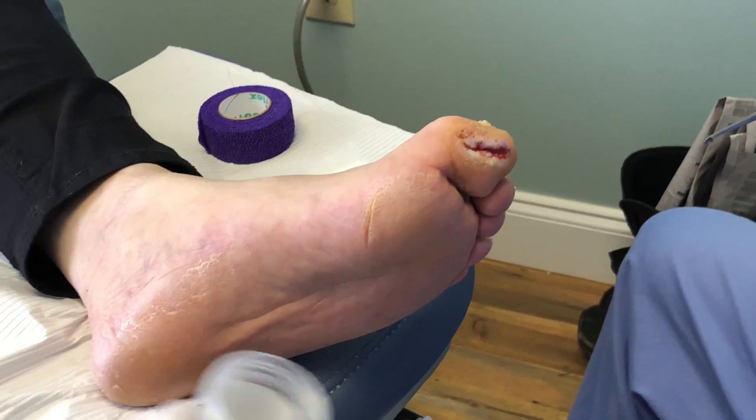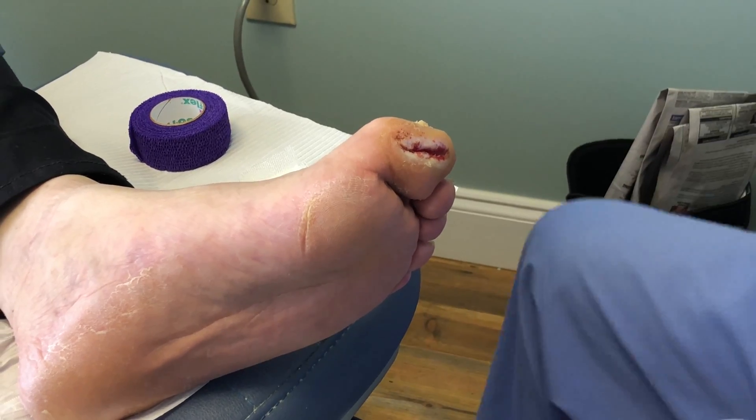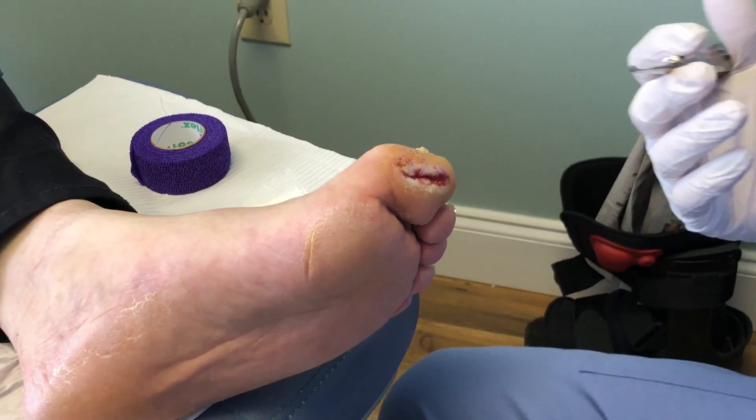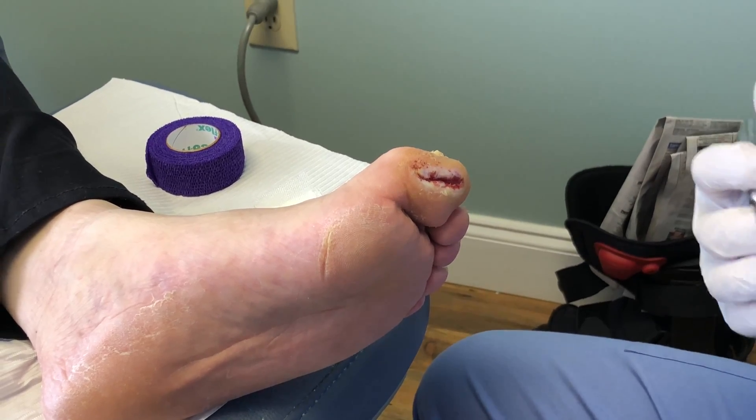This is Dr. Todd Brennan with Healthy Feet Podiatry. Today we have a chronic diabetic wound that we're actually going to do a platelet plug for. You've seen in the past we do PRP injections for Achilles tendonitis, plantar fasciitis, or any type of tendonitis.